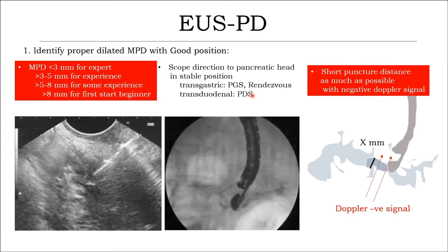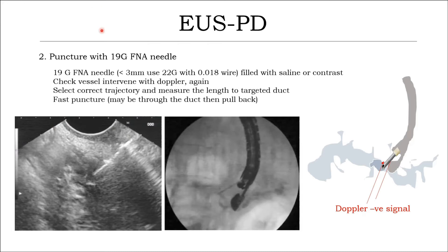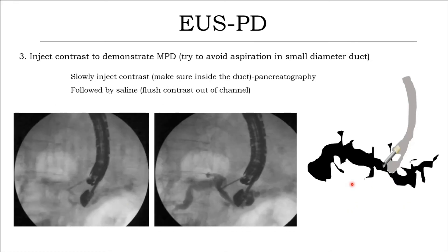Keep the scope direction toward the head of the pancreatic duct. Keep the puncture distance as short as possible and confirm a negative Doppler signal. Step 2: puncture with a 19-gauge needle. Remove the stylet, fill with saline or contrast, check for vessels in between, then correct the direction of the needle. Target the dilated MPD with a fast puncture into the duct and then pull back. When the needle tip is seen in the dilated MPD, check contrast to demonstrate the pancreatogram, followed by saline to flush the needle channel.